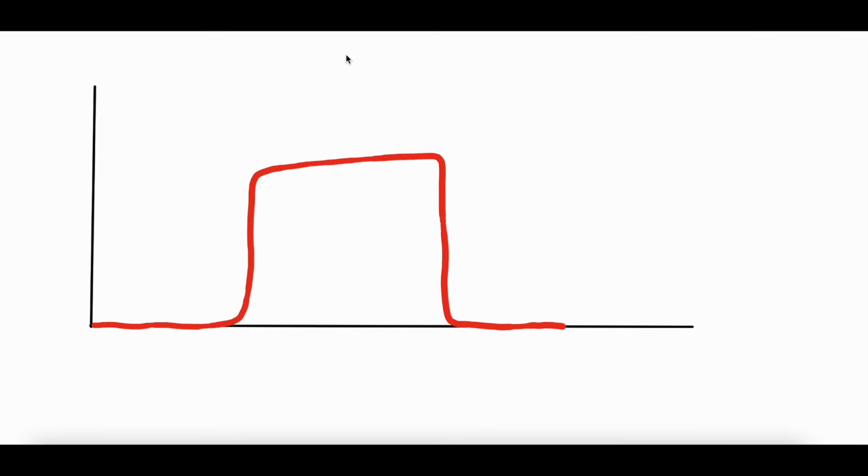We're also going to put questions on our Patreon page, so definitely check that out. But I want you to label this whole thing and think about the different phases. So pause it here if you want to do that on your own. If not, we're going to slowly do it with you. So the y-axis is the end tidal CO2 measurement, right? And the x-axis is time.